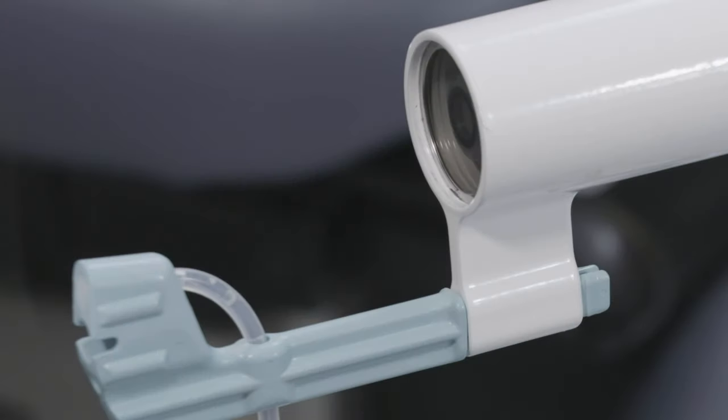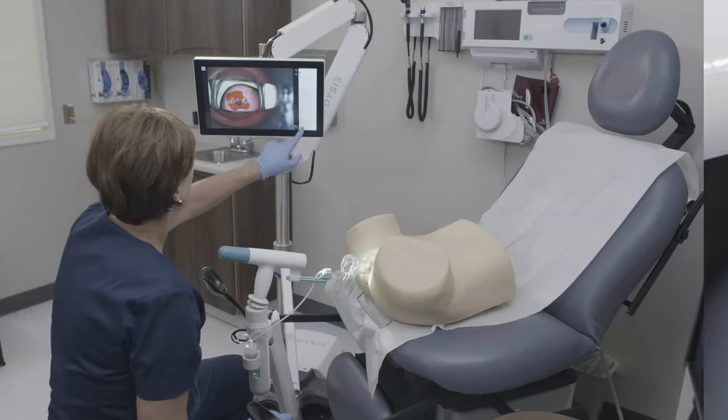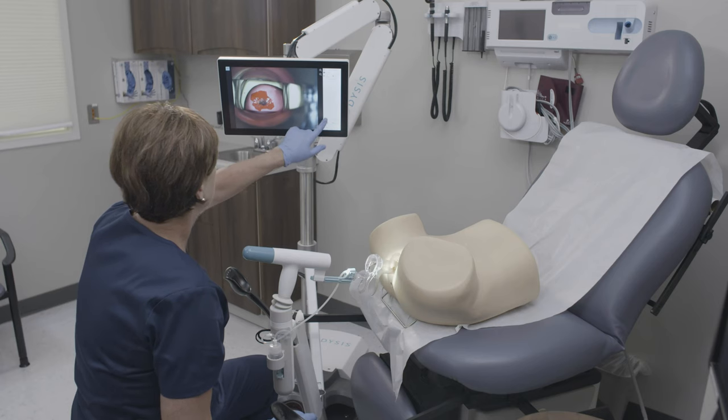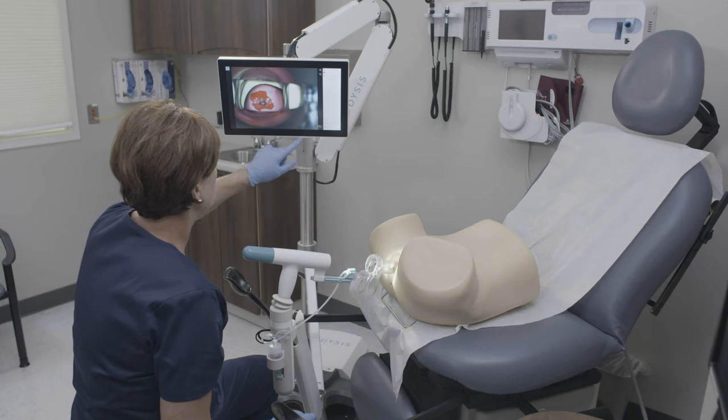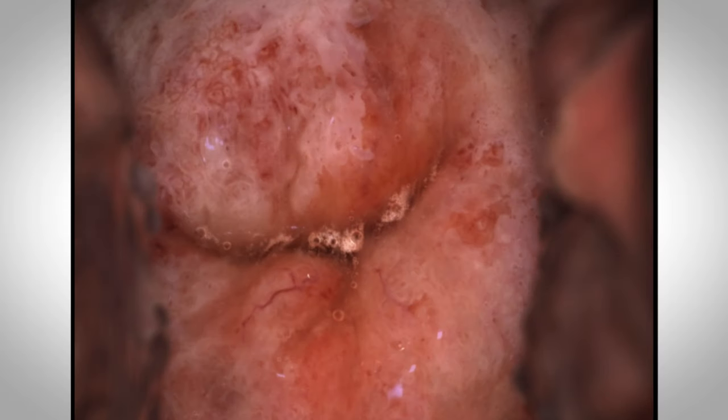The acetic acid is automatically applied for homogeneous coverage over the cervix and the imaging starts automatically. A standard visual colposcopy can now be performed. In the background, DYSIS is timing and measuring the acetowhitening reaction.